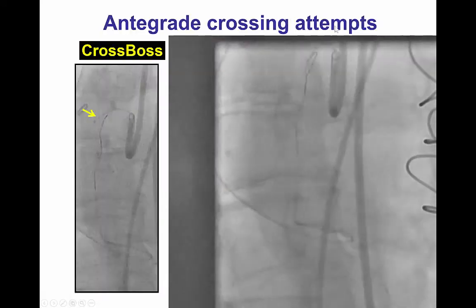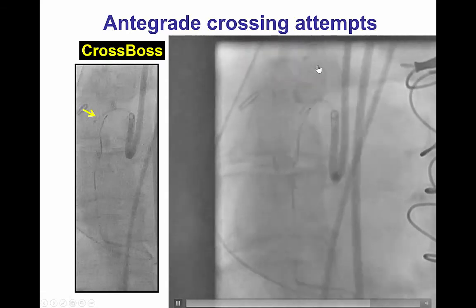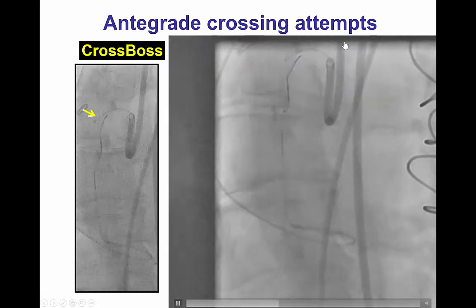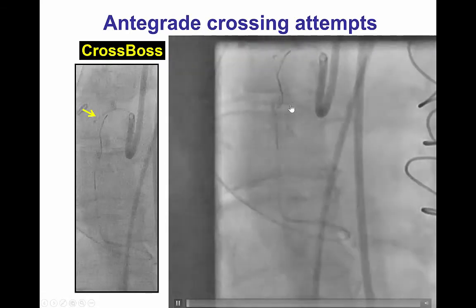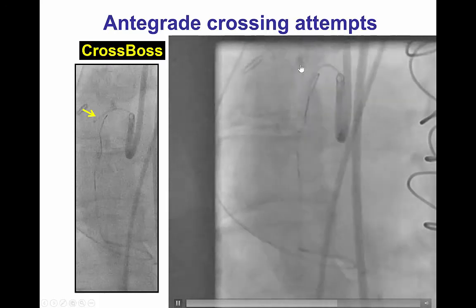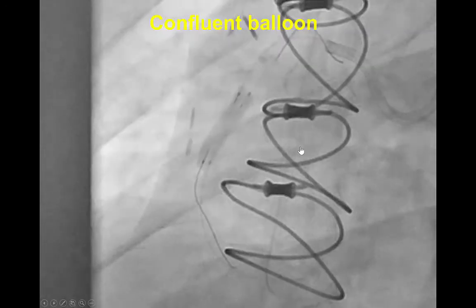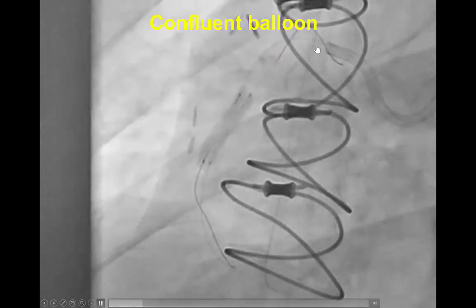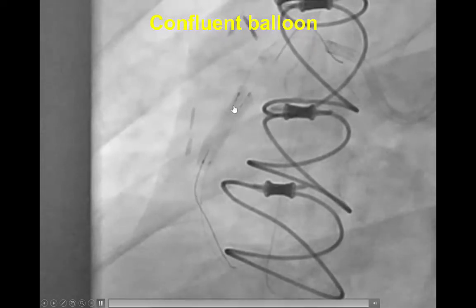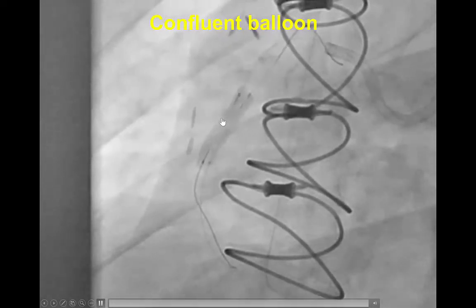We tried to cross using the CrossBoss catheter, which initially went in the right direction, but then it appears to be taking an outside course from the course of the retrograde guide wire. Eventually we changed to an antegrade guide wire that was advanced subintimally into the mid and distal right coronary artery.